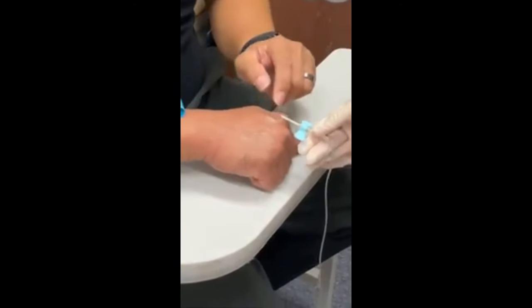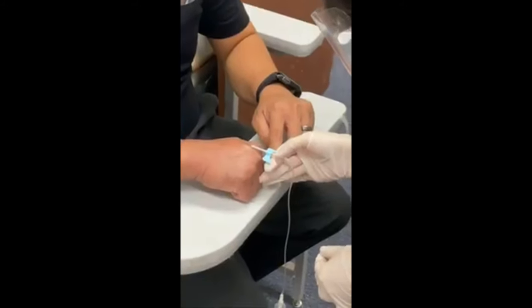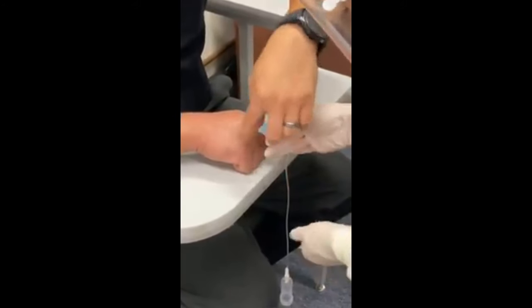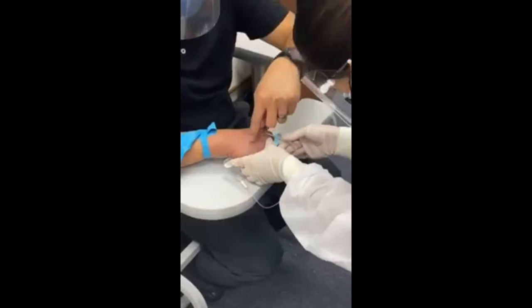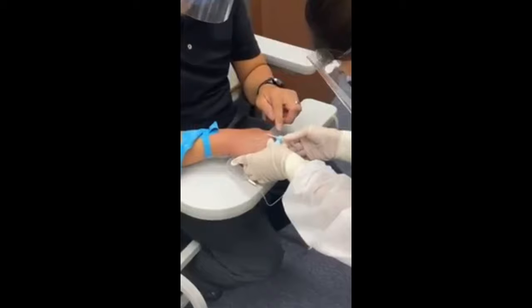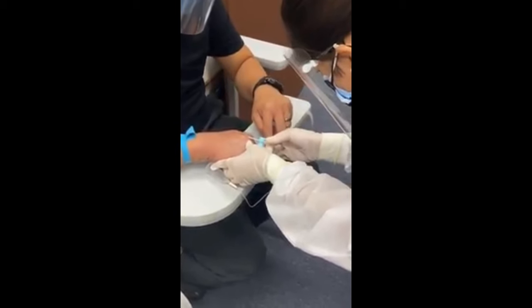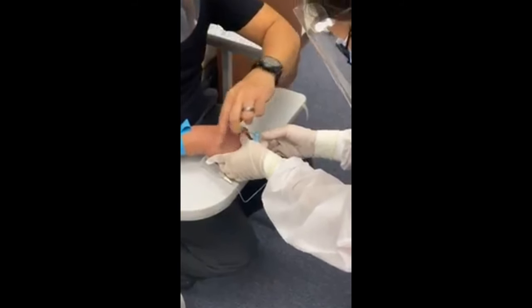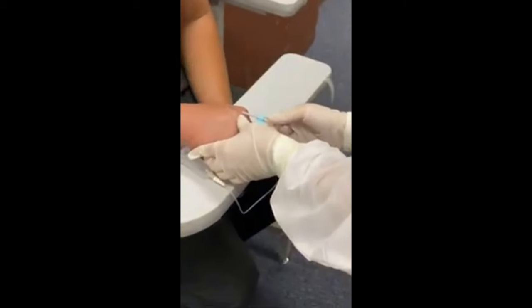Okay. So it's kind of tricky because it's the edge here. As long as you're touching your hand here for support, and you have control of the needle, and your other hand here is anchoring the vein, and then that could just hang here. Perfect. This is exactly right. Do you feel comfortable, more control of the needle? You are holding the phlebotomy chair because you have a supported needle. Good. Anchor. Perfect. Straight. Perfect. Exactly just how you're holding it.